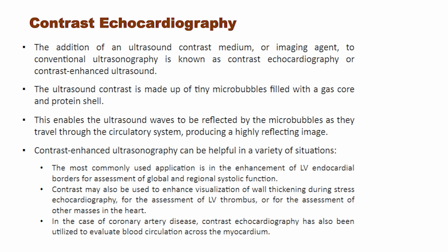Contrast echocardiography needs to be addressed in brief also. The addition of an ultrasound contrast medium or imaging agent to conventional ultrasonography is also known as contrast echocardiography or contrast enhanced ultrasound.